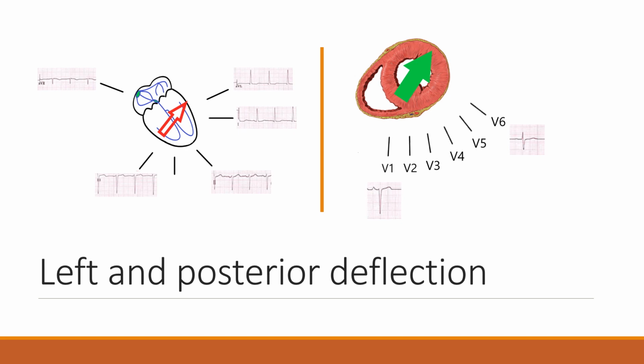Now, a lot of people use this little cheater thing for cardiac axis. Again, I hate all of those things. Yes, it's accurate. Some people do the thumbs up, thumbs down thing. It drives me nuts. All it breeds is codependency, and it robs the provider of conceptualizing what you're trying to look at, which is what actually matters. I see people pull out little cheat sheet cards they keep in their pocket. That is useless. Just take 5 minutes and learn this. You can see the whole concept here.